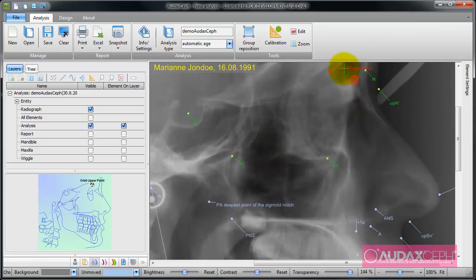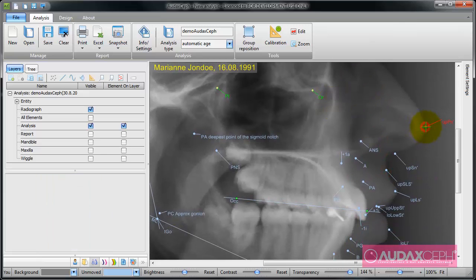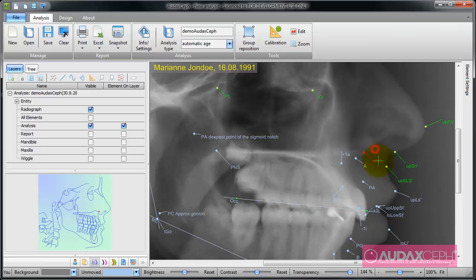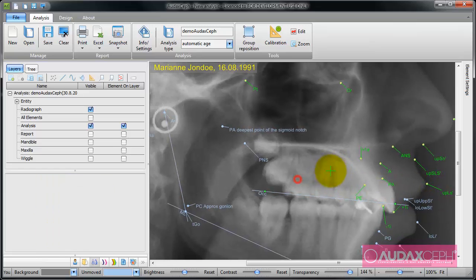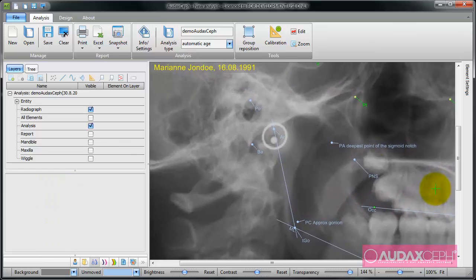You can note that when I move a point it changes color. This is how I know that the point has been moved to the right place.